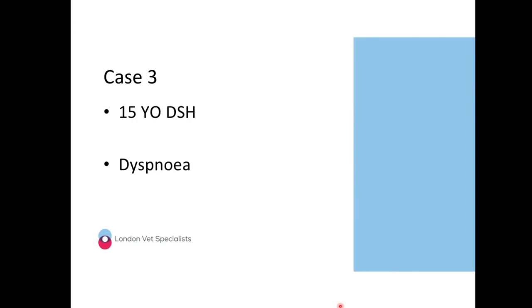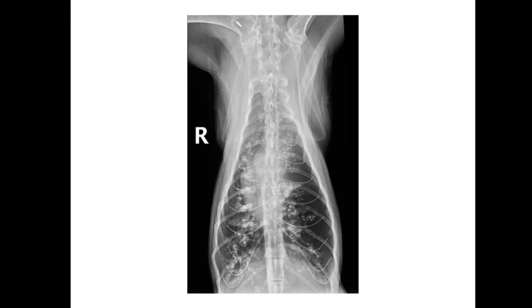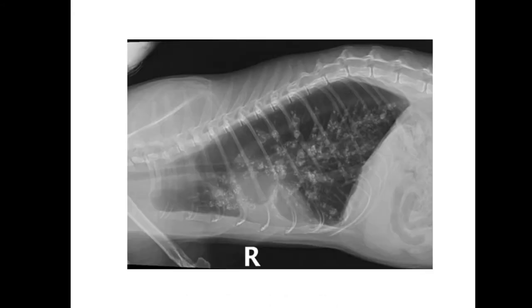Case number three is a little bit different — it's a 15-year-old domestic short-hair that's presented as dyspneic. A couple of radiographs to look at: we've got a VD and a right lateral thorax. Would anybody like to have a go at case number three? I can have a go. We have two radiographic projections of a skeletally mature cat — one is a right lateral and the other is a DV.